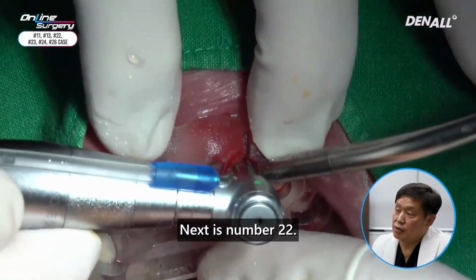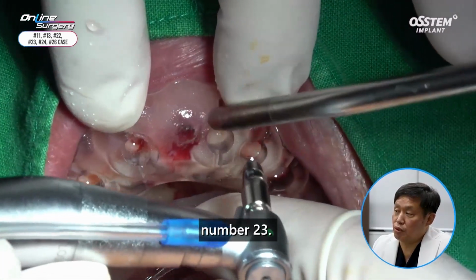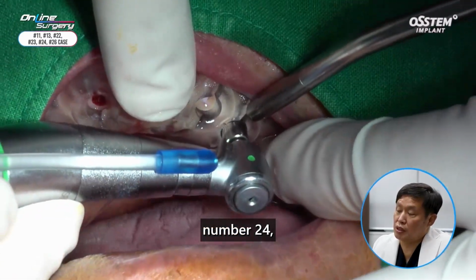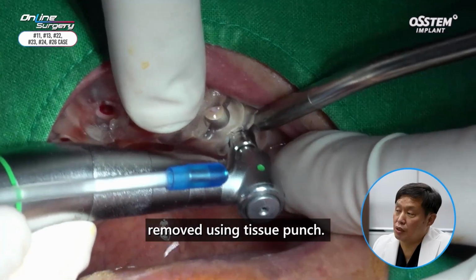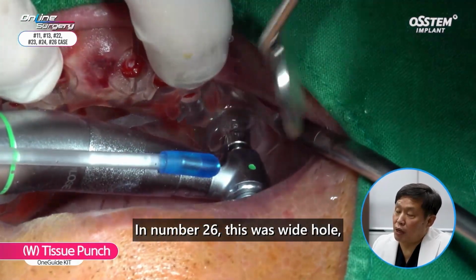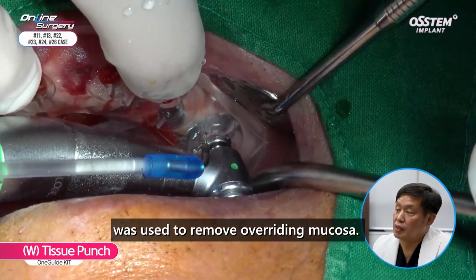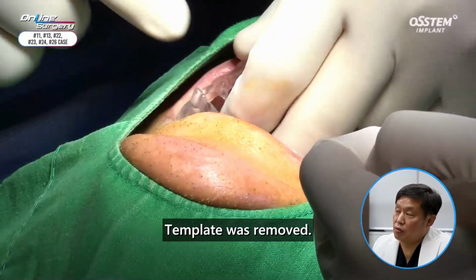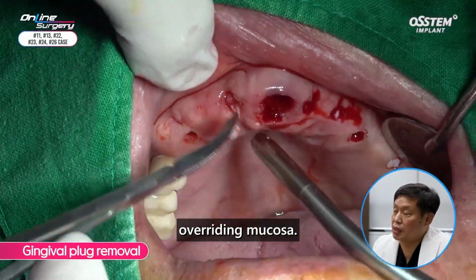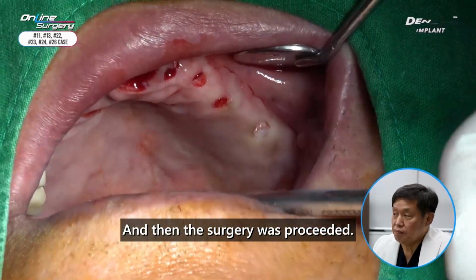Next is number 22, number 23, number 24. Overriding mucosa was removed using tissue punch. In number 26, this was a wide hole, so a wide tissue punch was used to remove overriding mucosa. Template was removed. I checked whether there was any remaining overriding mucosa, and then surgery was proceeded.